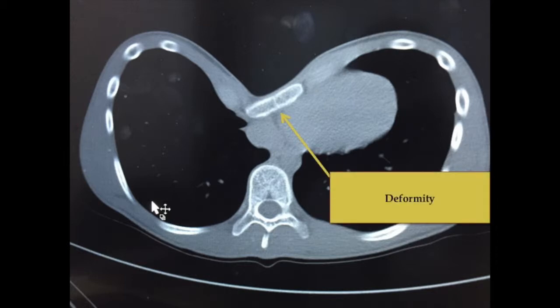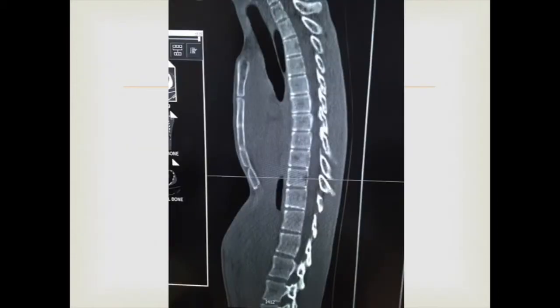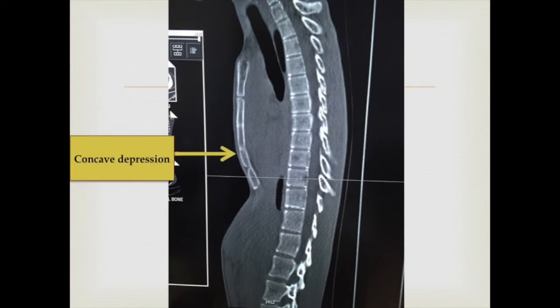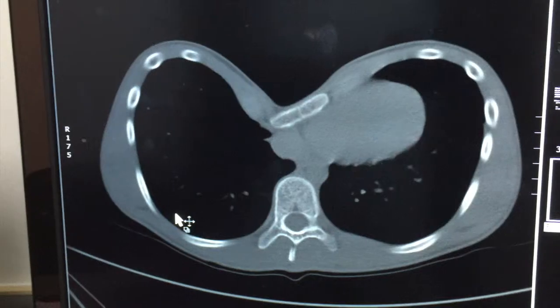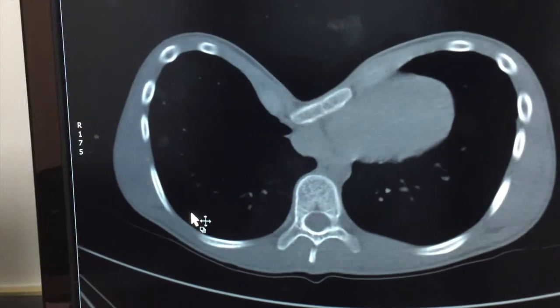This is the sagittal view of the CT scan, and here you can see the concave depression of the sternum. Don't forget to exclude scoliosis — funnel chest is usually associated with congenital scoliosis.